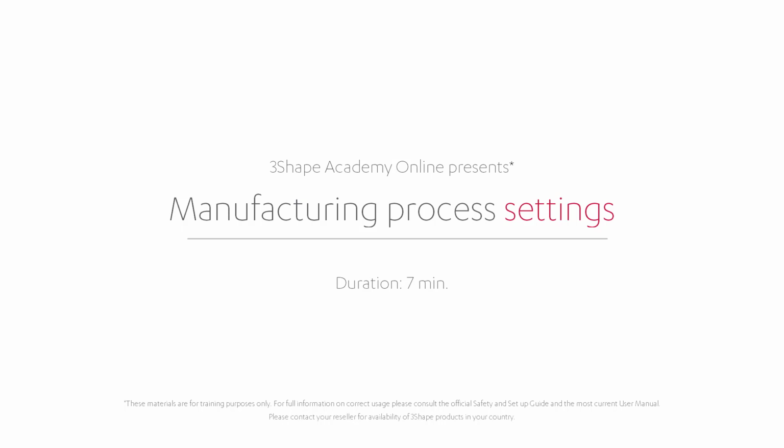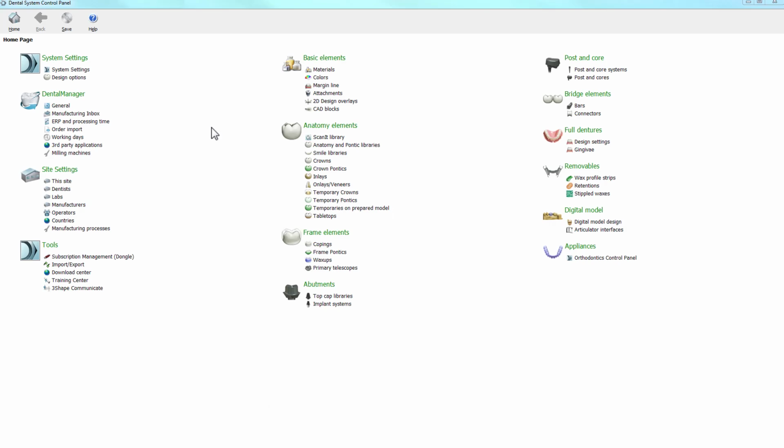In this video, we will show you how to set up a manufacturing process in the control panel. If you are a milling center or manufacturer, you have the possibility to create your own manufacturing process in the control panel. Setting up a manufacturing process allows you to connect specific materials to specific manufacturing processes. It also gives you the possibility to select the required DLL manufacturing process to generate the correct CAM output.